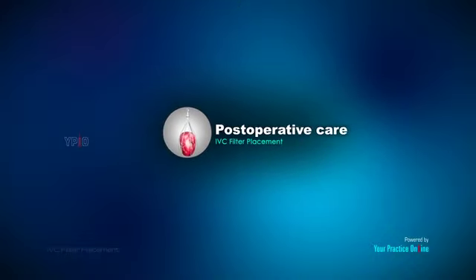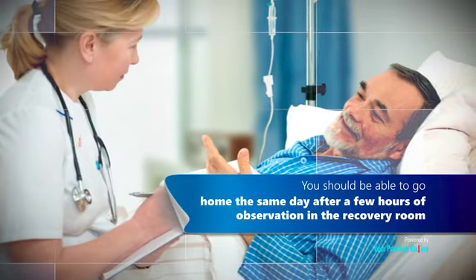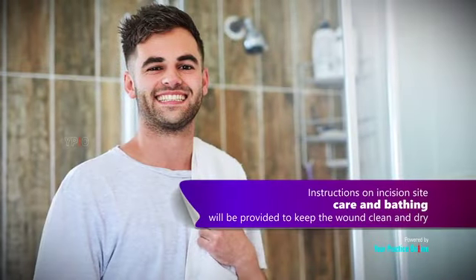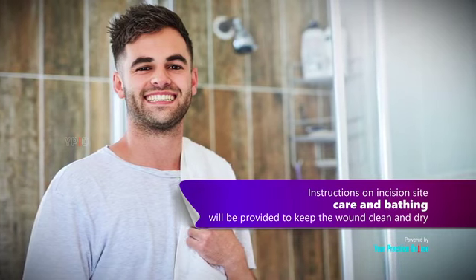Postoperative care. Following the procedure, you should be able to go home the same day after a few hours of observation in the recovery room. You may feel sore or have some swelling at the catheter insertion site. Medications are provided as needed to address these. Instructions on incision site care and bathing will be provided to keep the wound clean and dry.